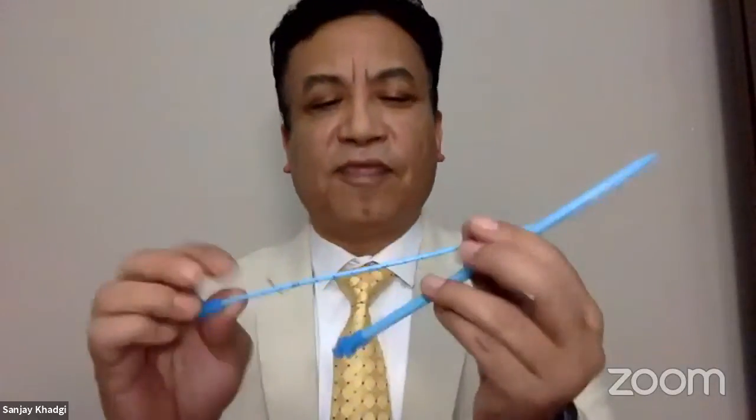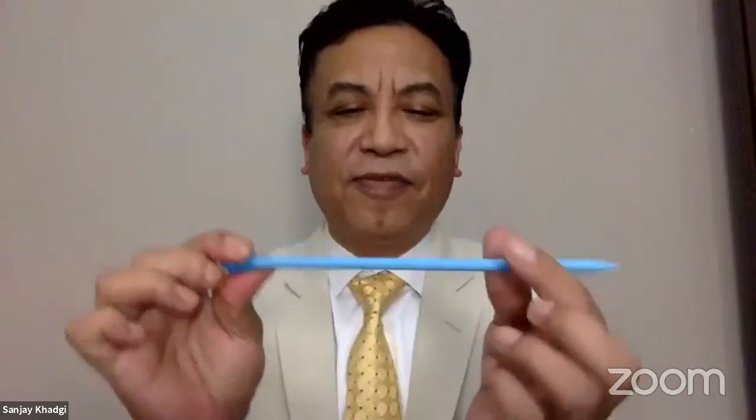No, it's from China. And that will facilitate the advancement of the 18 French sheath. These are the fascial dilators I use, from China. This is not as soft as what you get in India. This is somewhat stiffer, and it has a very fine tip, which is less traumatic. So that's my routine practice. Is it available in Nepal, or do you have to get it from China? It's easily available in Nepal, and I also get it from China.